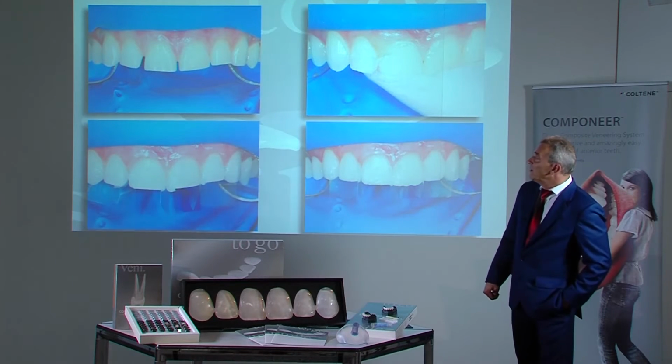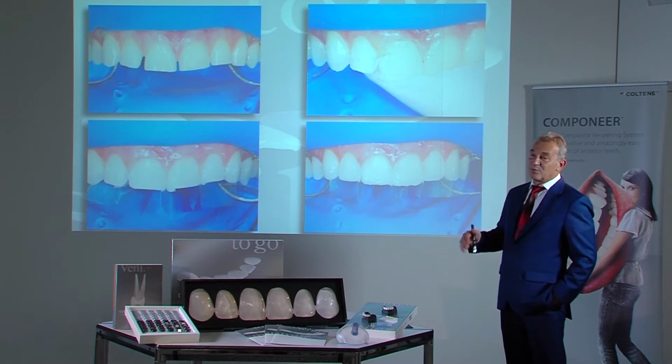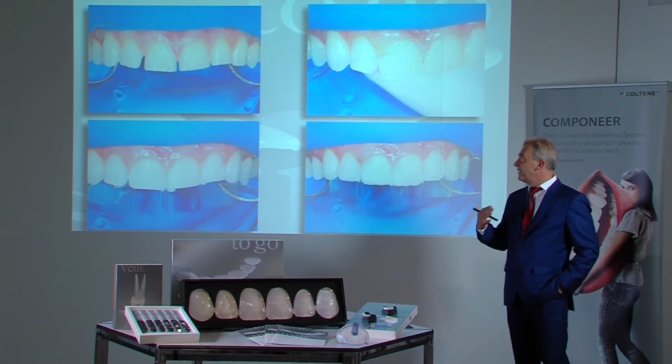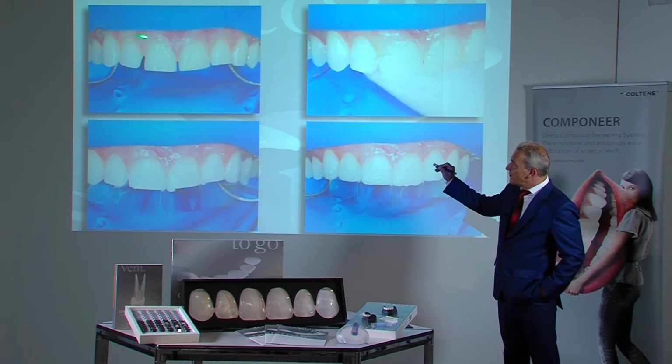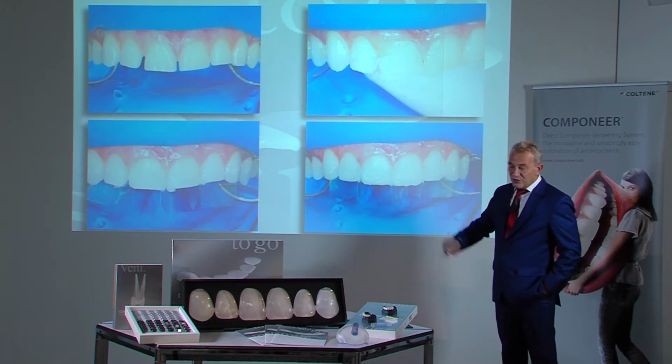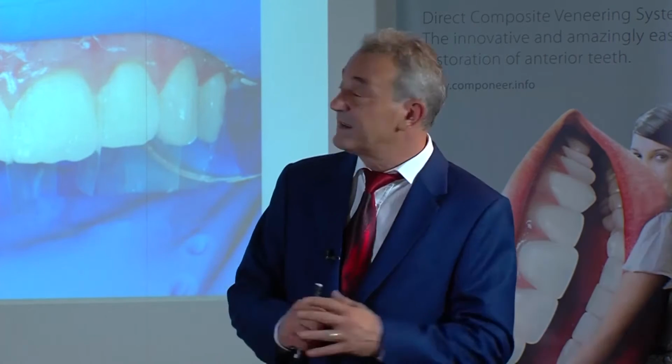On the one hand, the gap had to be closed. On the other, the tooth proportions needed reconstructing. In addition, a slight shift forwards was undertaken to round off the tooth arch. Then also complete this line again. And if the gaps are in the center, continue to the lateral teeth.